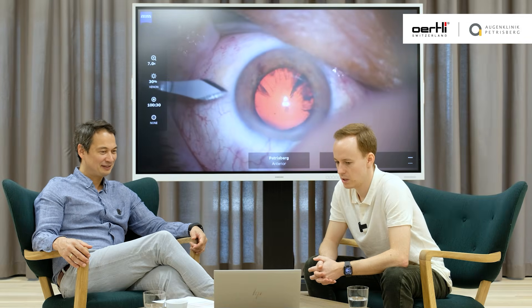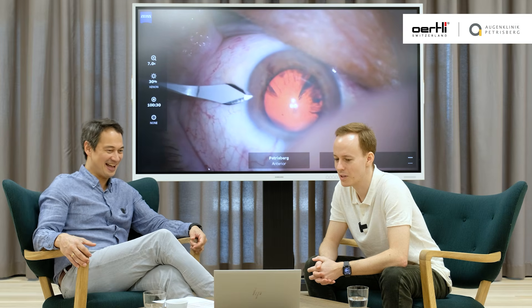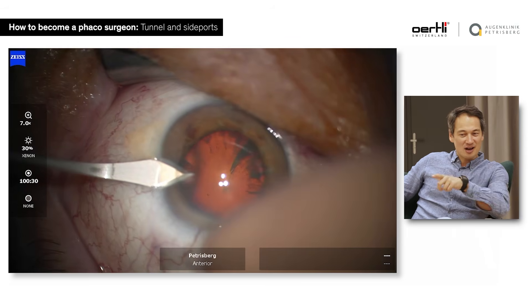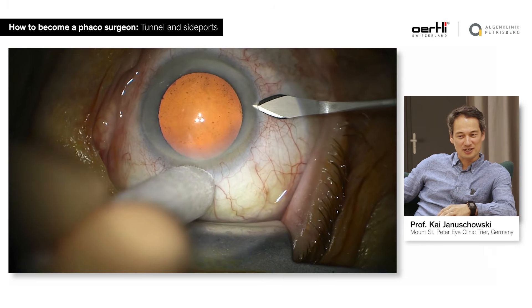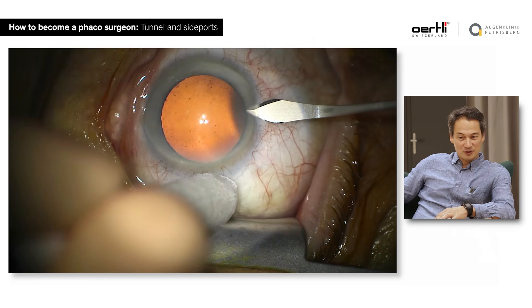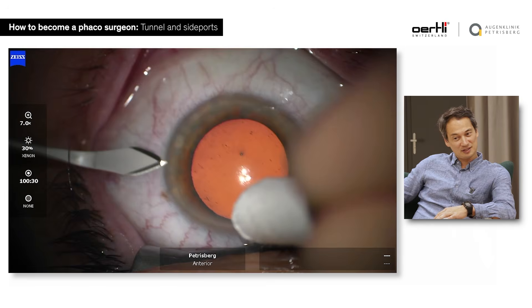This is real time, and also the tremor is in real time. The tremor is brilliant. What you see regarding the tremor is that you don't have a natural tremor — you're not really naturally shaking. It is just that one is excited and you don't really have the perfect position of the armrests.